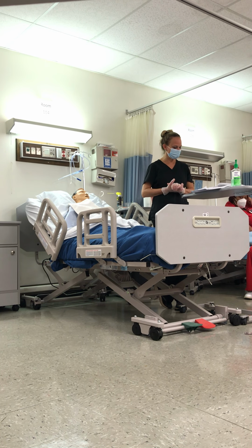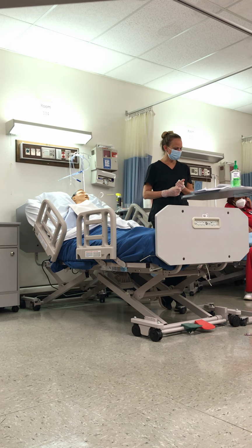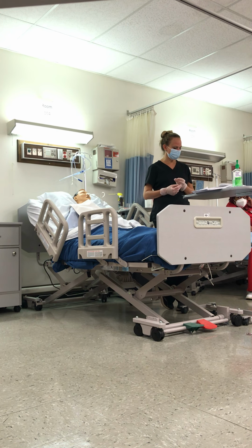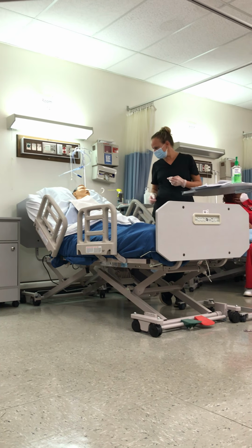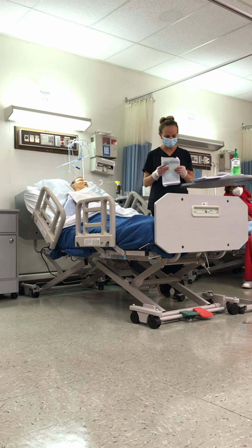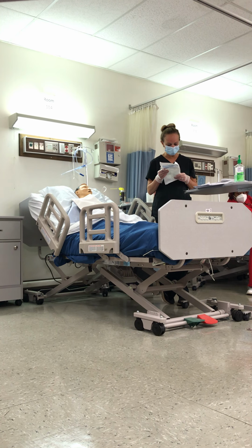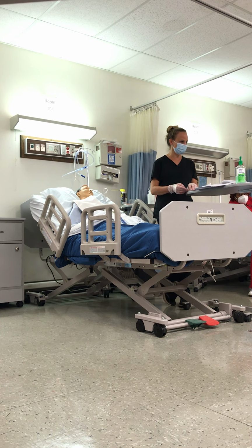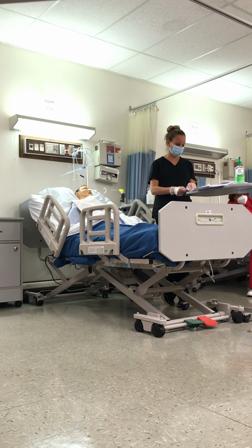So we've assessed the placement. What else can we do to make sure that we have placement? X-ray. Okay, this tube has to be an X-ray detectable tube. I think all these are X-ray detectable at this point, I don't know that, but you have to have an X-ray detectable tube, because what if you take an X-ray of a tube that's not X-ray detectable? You may not see it. I see it.